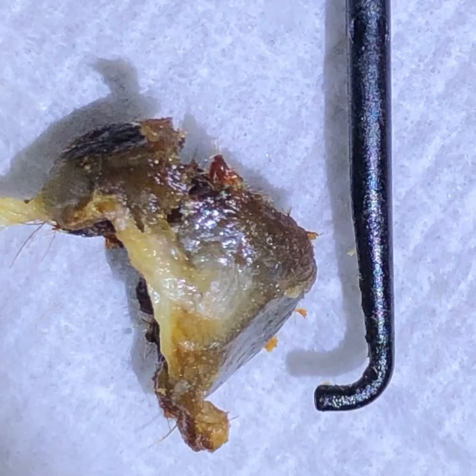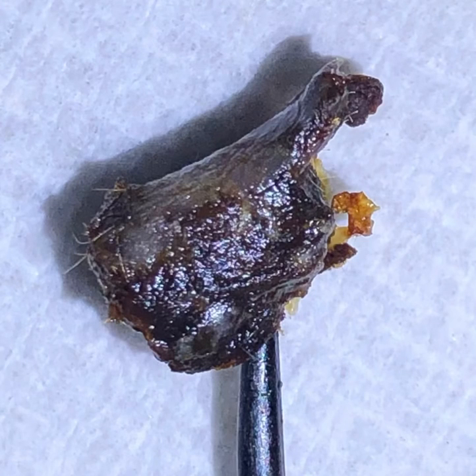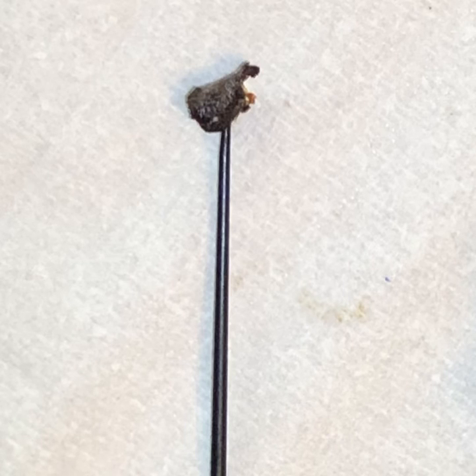For that reason the eardrum has just become slightly vascularis, but it's fine. That's the size of the wax plug — this is a young child, remember, so it's quite a significant haul of wax. I've got the ear hook beside it. This is the opposite angle — when I first removed the wax plug from the ear hook whilst the ear hook is still embedded into the core of the wax. And here is a more zoomed-out image to give some better perspective.